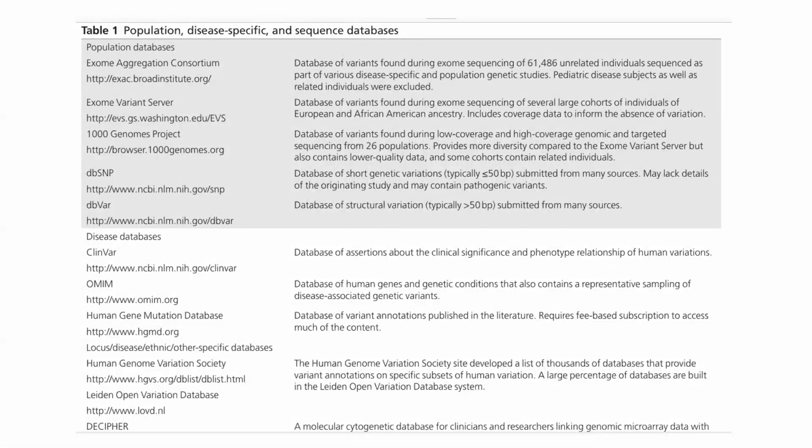And the very first thing you need to do when you collect the data for looking at an NGS or a Sanger or anything to understand disease-relevant mutations, the first thing is you have to remove all the polymorphisms which are present, because they are harmless. They are just present in different individuals across the globe. It's more population specific. Therefore, you call it population databases.